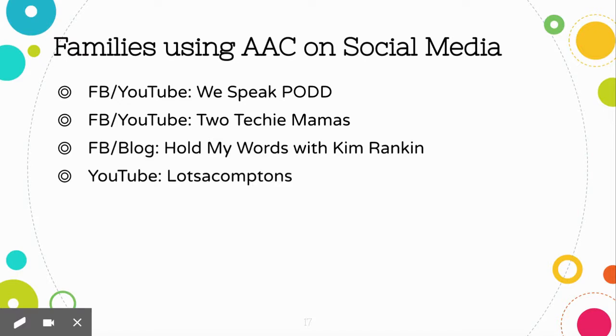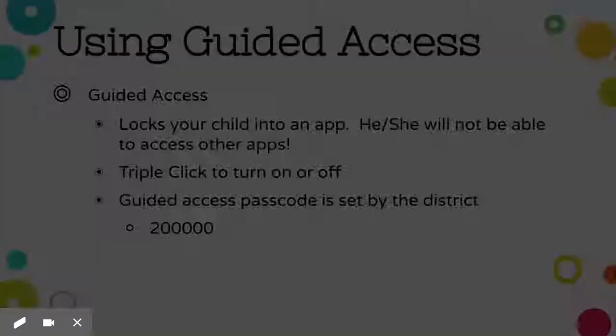Hold My Words is a family with 1 child who uses AAC, specifically an app called Speak for Yourself. And then she also homeschools her child, so she shows how she incorporates the device into school activities as well. And then Lots of Comptons is the family from the 2 YouTube videos that we already watched. They have lots of short videos on their YouTube channel to show how to model in different activities with the device at home. If you stumble across another great family using AAC on social media, let me know. I'd love to be able to share it with other families.